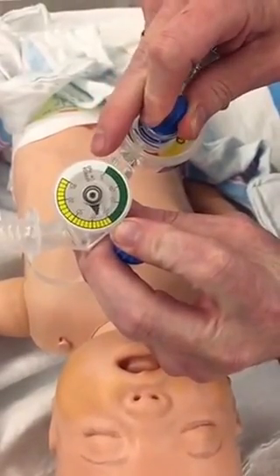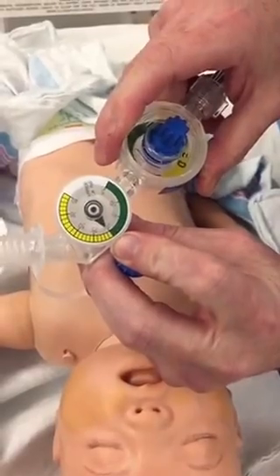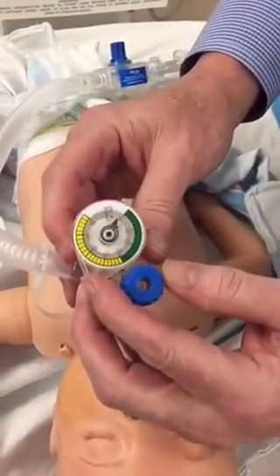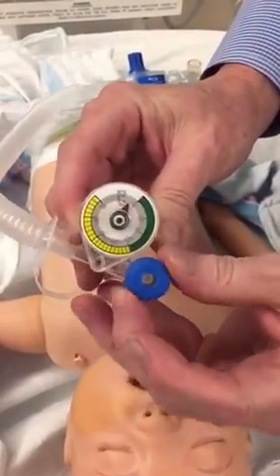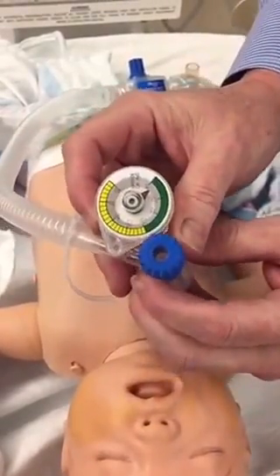In this case I want to set it at 20 as my max pressure. Now I'm going to release that and you can see that there's actually a PEEP on there of 5 already. This knob on the front actually takes off the PEEP or puts the PEEP back on. At this point I've now set it at 5 and 20.